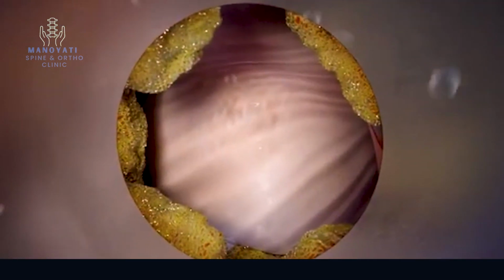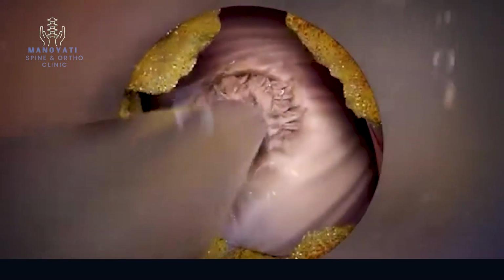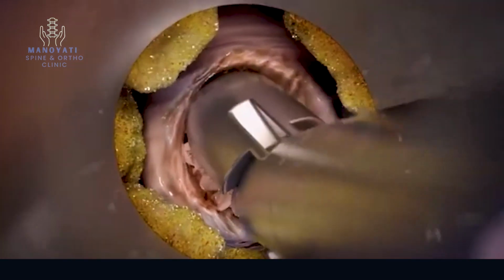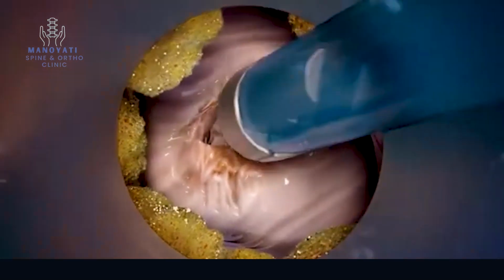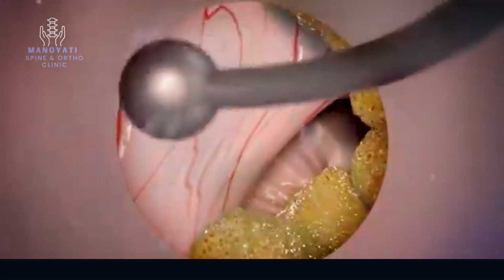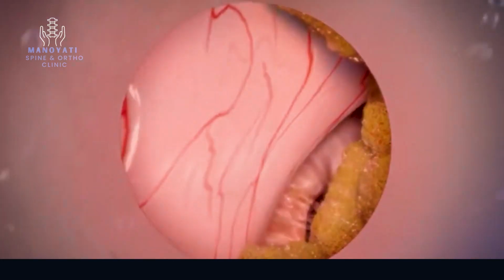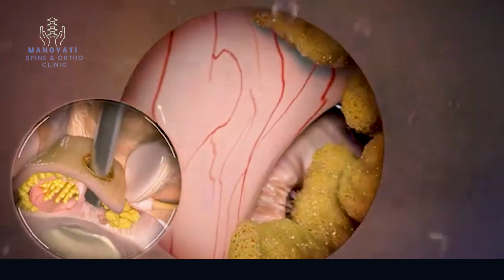With the nerve root retracted and protected, use a blunt instrument, such as an elevator, to put pressure on the annulus, releasing the nucleus pulposus. Next, use grasping forceps to extract the exposed nuclear material. Use the electrosurgery probe to ablate nuclear material and minimize the annular defect. Once complete, slowly remove the scope and cannula.